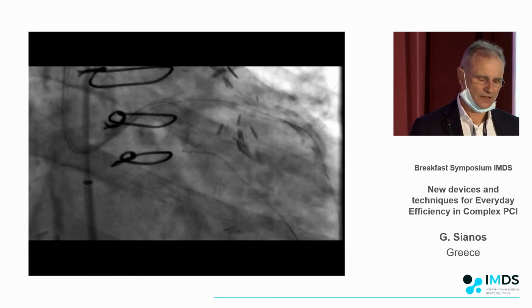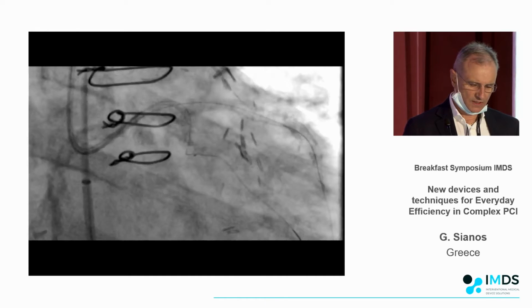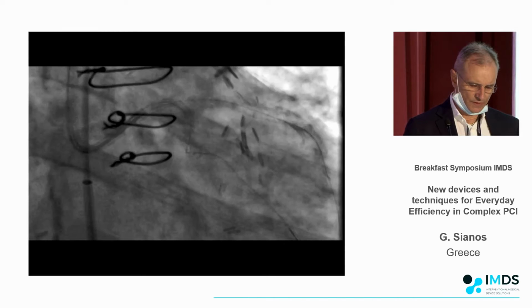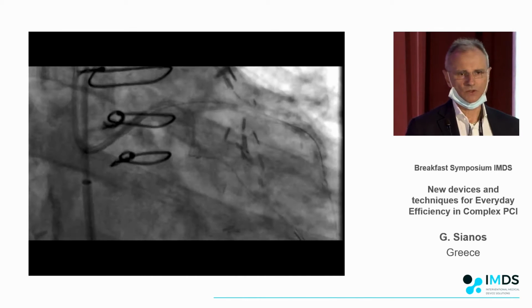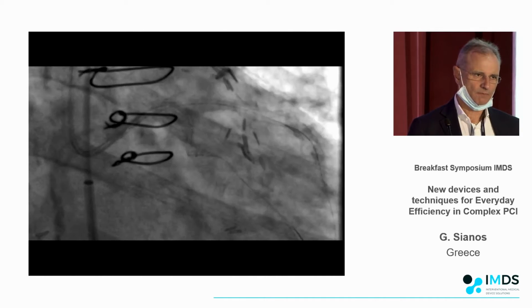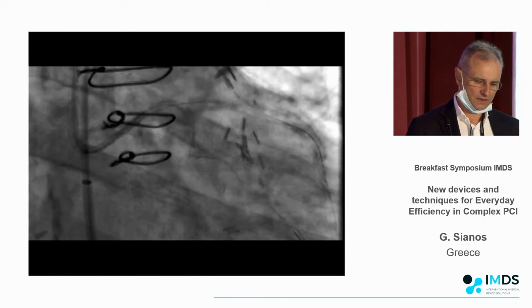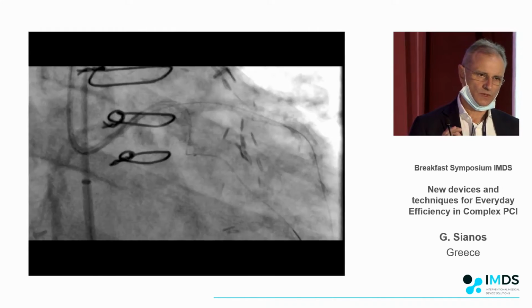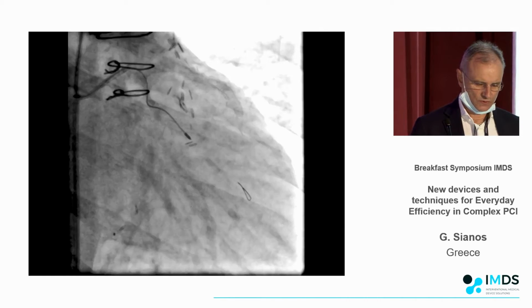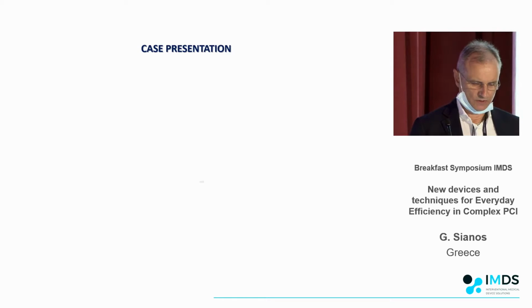this occlusion, this lesion cannot be tackled easily with a Blimp for one simple reason. Because the vessel proximally is so tortuous, you see the divergence of the Blimp away from the wire just because of this proximal tortuosity. So vessels that are extremely tortuous proximally from the target, because the balloon has such a short monorail, it is a disadvantage, but confirms what I told you. The alignment with the wire is the major issue here. This specific lesion was rotablated, and it was finally successfully treated.